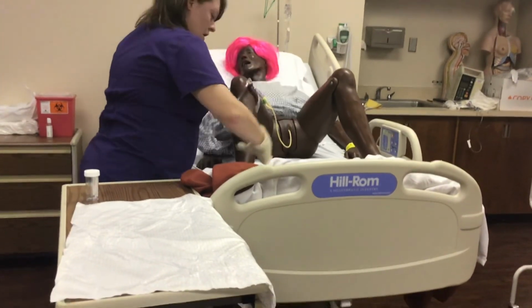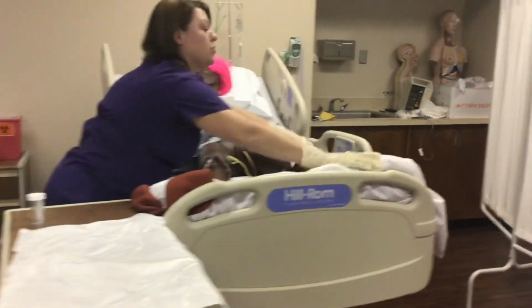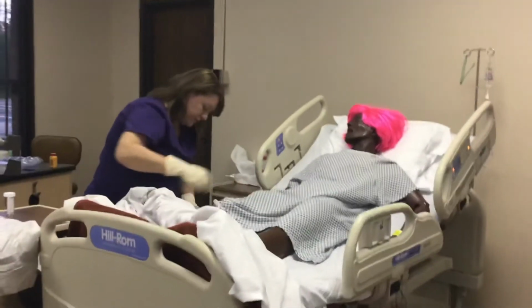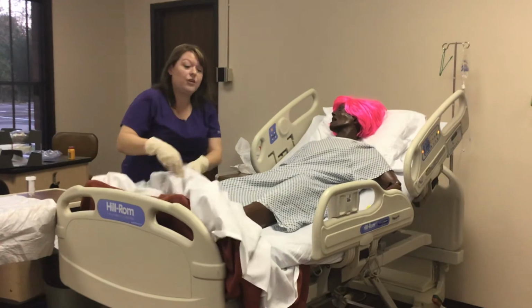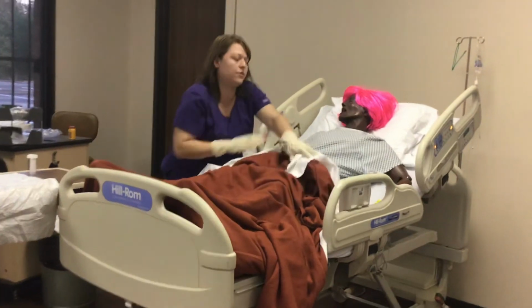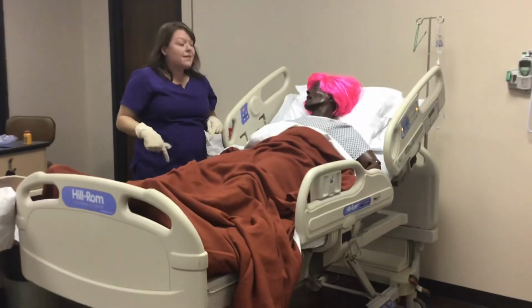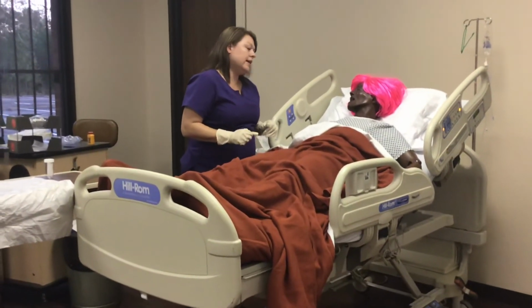Now, Mrs. Shelton, if at any point since we've done this, you start feeling a strong urge to go to the bathroom, like your bladder is full, and you don't see it draining into the tube, I want you to use your call bell and let us know, all right? Also, whenever you get up to go to the bathroom, or if you get up to move around for any reason, not really for the bathroom, you shouldn't really need that because you have a catheter unless you have stool, and that is perfectly fine. But whenever you go, you need to make sure that the bag stays below bladder level or waist level, and you don't want to drag it on the floor, okay?